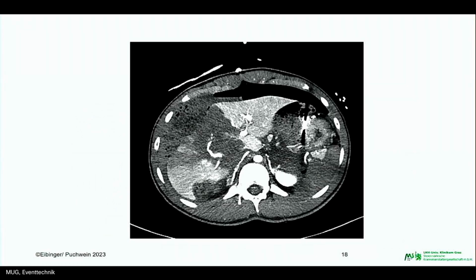This was a CT scan performed after surgery. Here you have the disruption, the complete disruption of the liver. This white thing inside here is some gauze because the patient underwent a hepatic packing. So we put some gauze around the liver and compress it, and then you close the abdomen. So what was done: first the liver packing, and 2 hours later, a segmental resection was performed because the patient was getting into stable conditions.